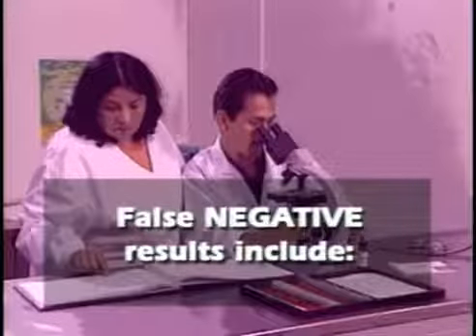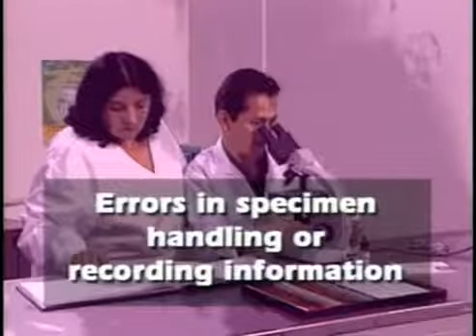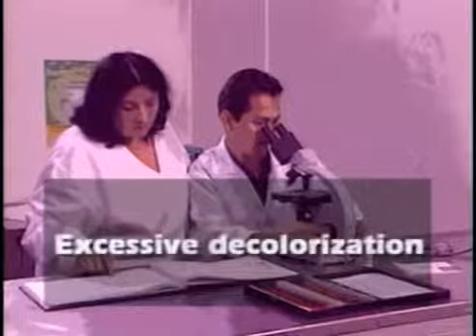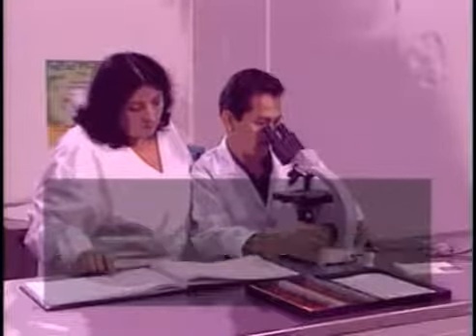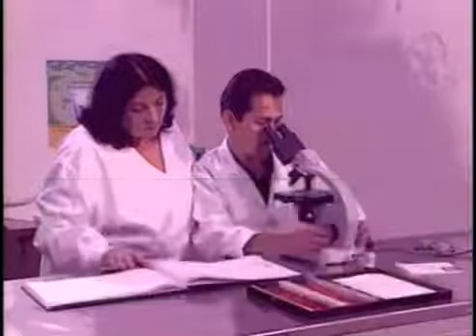Some reasons for false negative results include errors in specimen handling or recording information, poor quality sputum, excessive decolorization, reading fewer than 100 microscopic fields.